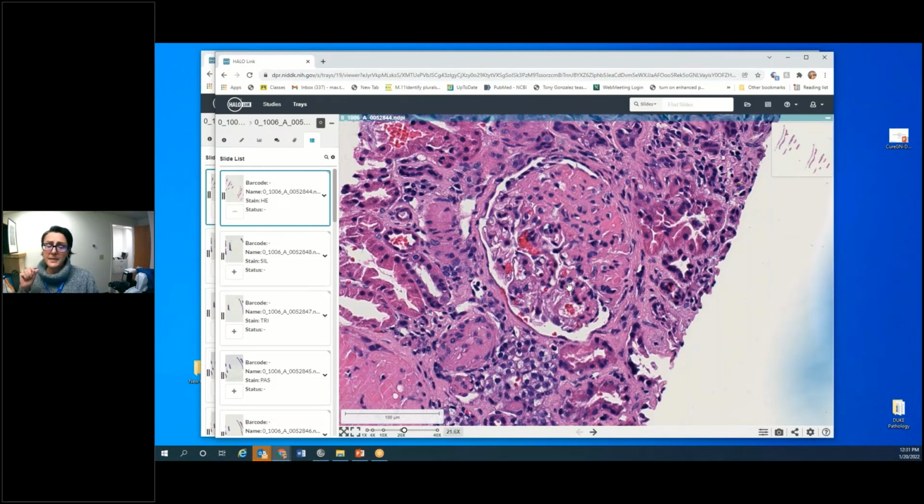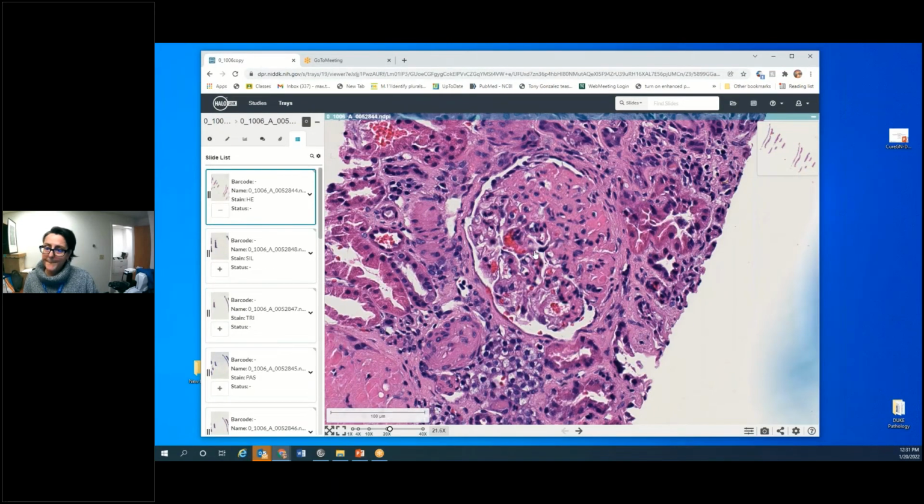Once you copy this into the CRF, anyone who wants to look at it again only has to open the link. It's a lot easier than what you used to do for annotation, where you search for the annotation, drop a pin, and then type. Now here, you click and copy, and then simply paste in the right space in the CRF where you said this is segmental sclerosis.